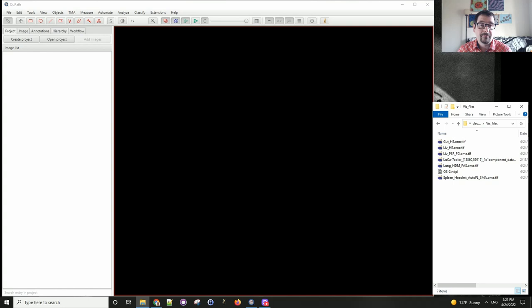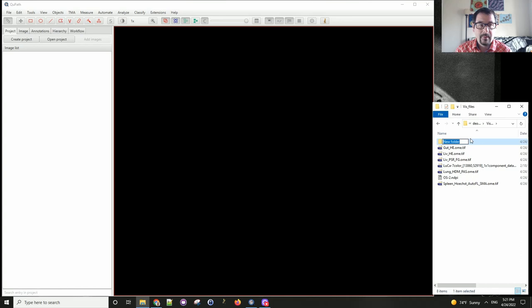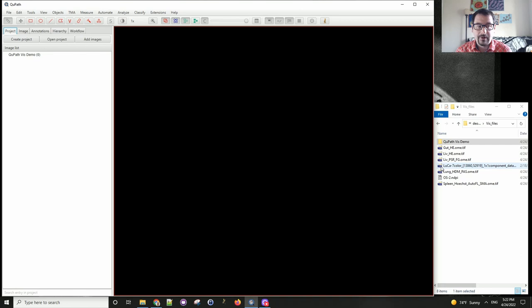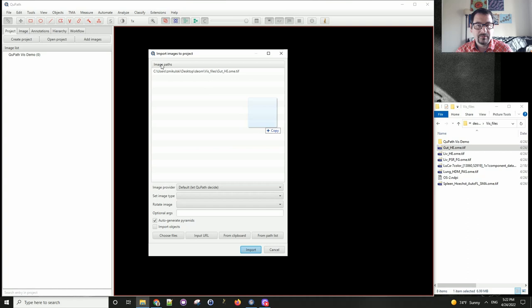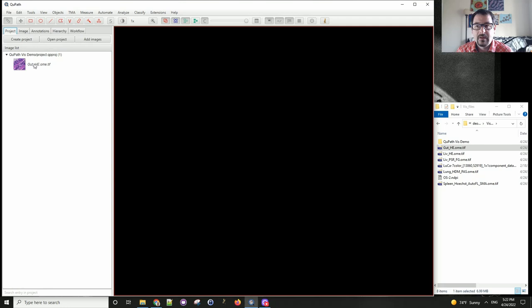When we start working with QPath, we always want to start by creating a project. To do that, I will create a new folder and name it something informative so I can find it more easily. By dragging this into the open QPath window, I will create a project for this empty directory. That directory needs to be empty because QPath wants to be able to overwrite anything it finds there. Let's start by working on our first image — I'm going to grab and drag this image of gut from the mouse that was stained with H&E.